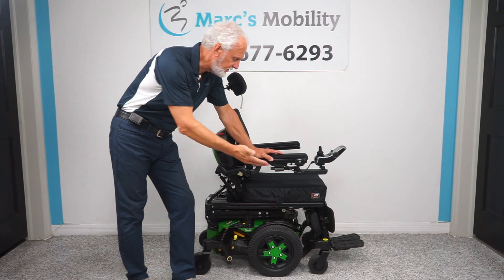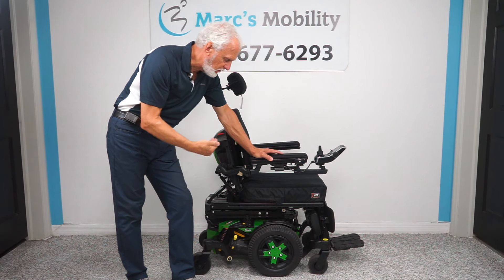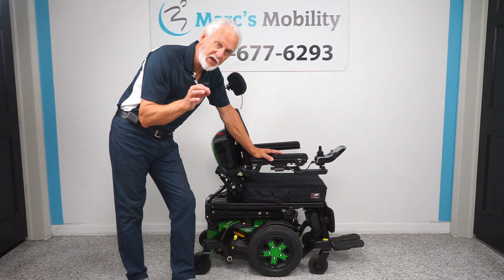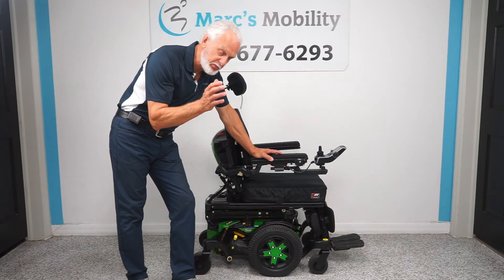It has the 12-inch seat lift, the electric tilt, the electric recline, the electric feet. Now this one here is one size smaller than the full-size Quantum chair. It's a Quantum but it's a Stretto. Stretto means a little bit smaller.